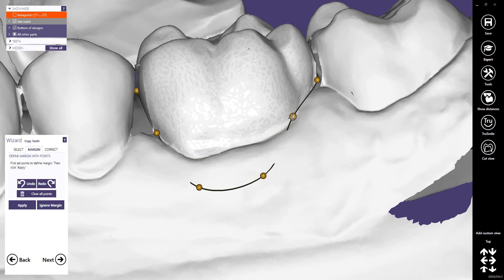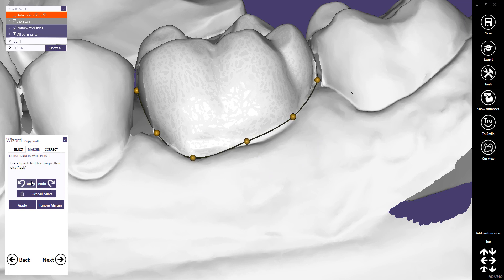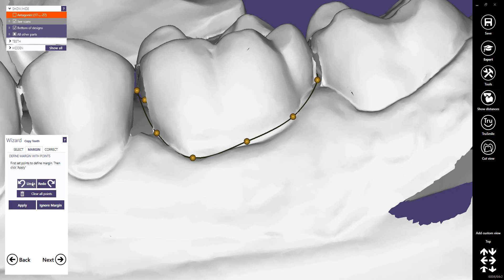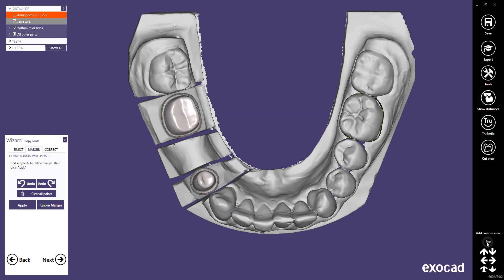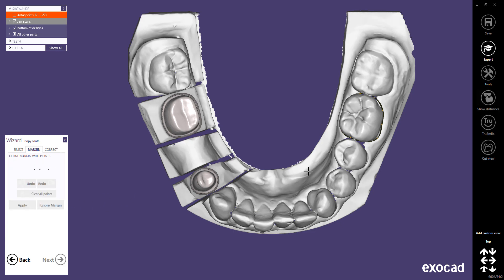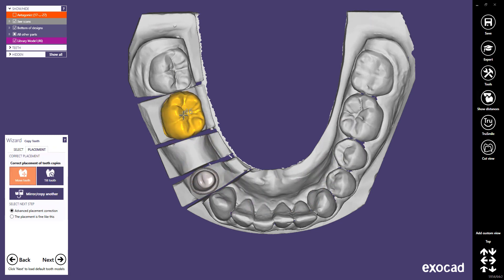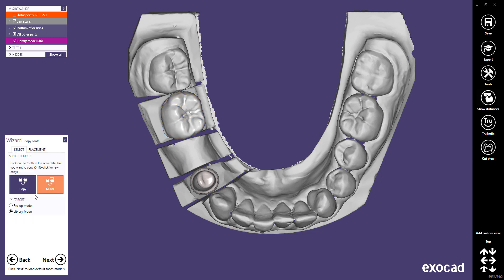Correct the margin by moving the points, or clear all points and draw the margin manually. Finalize the margin line with a double-click. Let's undo all these steps, as the tooth has been detected correctly. Click Apply to apply your changes, then place the tooth and confirm the position with a click. To mirror the second tooth, click the Mirror Copy Another button.